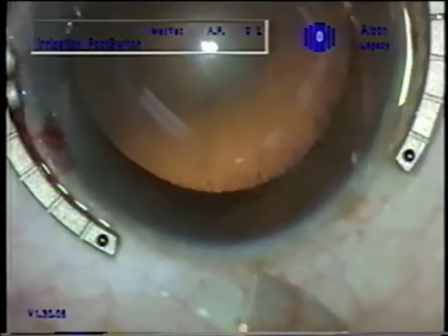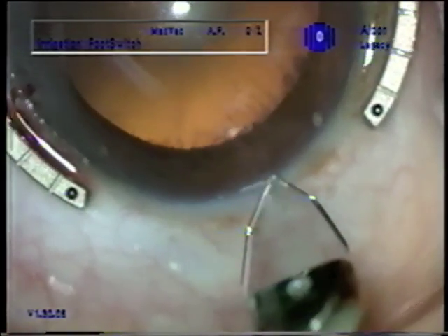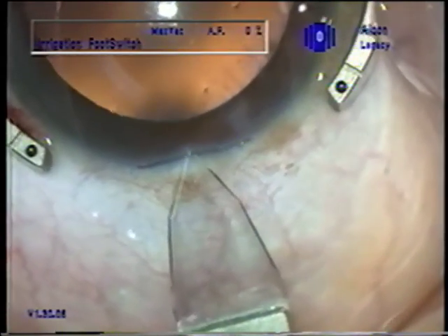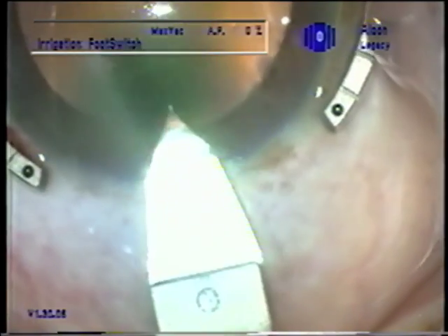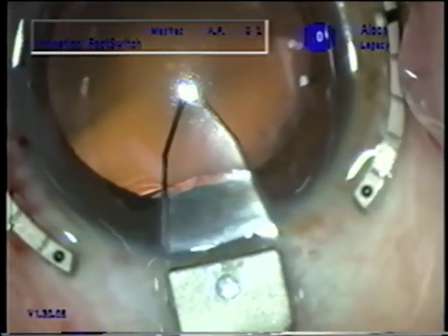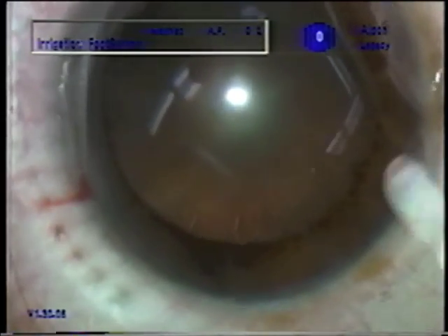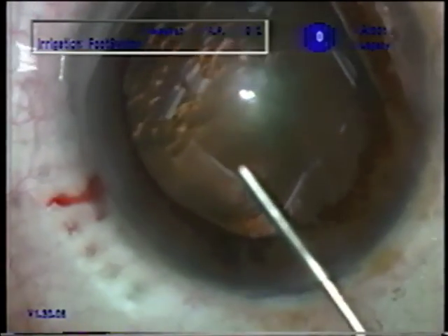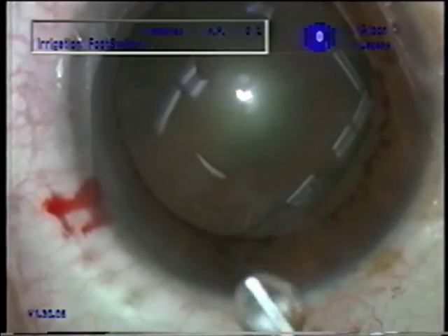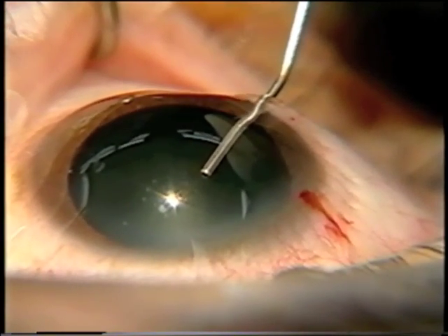We're just getting started with Earl here. I've made the paracentesis and put in some 1% lidocaine. We have had some lidocaine gel on the cornea. This is a Mastel 2.8 Stealth Diamond, and I'm making it a little larger because we're going to use a high infusion sleeve. We have a generous enough main incision, which the high infusion sleeve allows, and we can usually get the Monarch injector through that without enlarging.